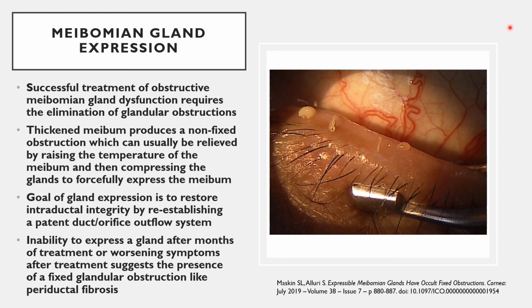I don't want to say you're wasting your time, because we have strong evidence, multiple articles, that photobiomodulation therapy as a monotherapy, a standalone therapy, works. Like I presented in option number one, where the guy came in for 4 weeks at a time and I didn't do anything else to him. They get better. They get a lot better, and it happens to a lot of them. This is even better than that.